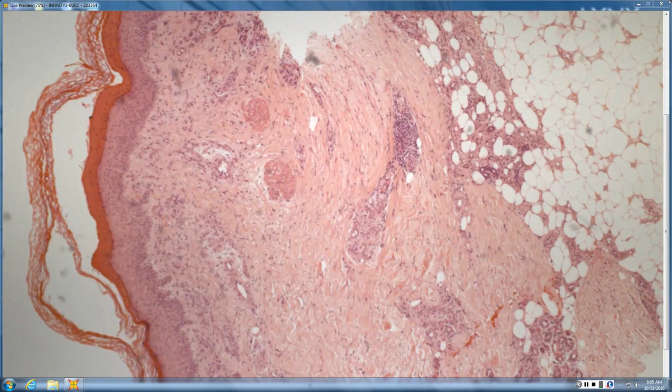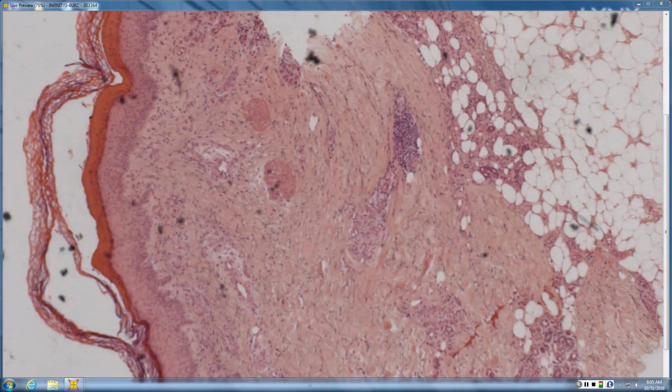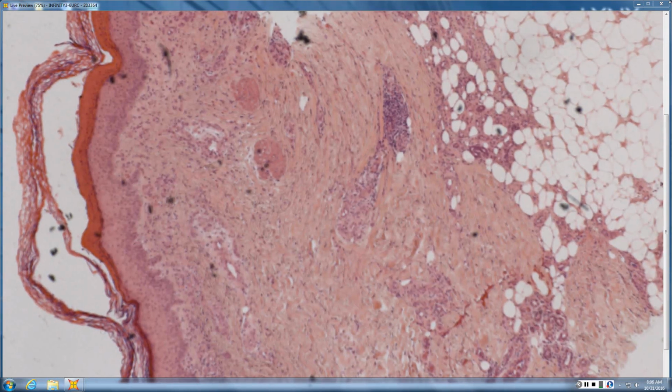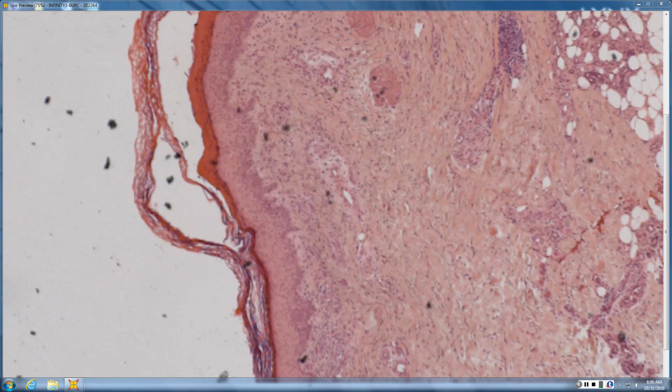Okay, Katie. So, a really compact corneum with some parakeratosis. You have superficial and deep infiltrate, perivascular and perineural. So tell me about the time course of the lesion. There's acute on top of subacute horn, so probably like a week or two old. Yeah, so this lesion is a week or two old because you still have your retained normal basket weave corneum, and under that you have a subacute horn that's parakeratotic and more compact.